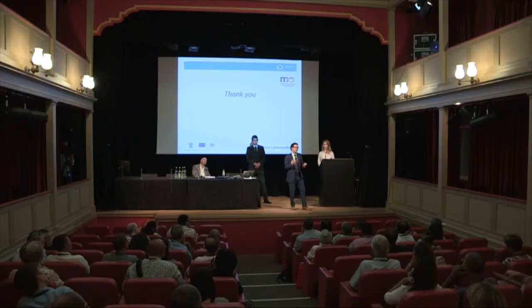But to respond to your point, the more information you can get, the better. It's clear with flicker that we don't have 35 minutes in an optometry practice, and that's why you have these commercially available devices that give you a snapshot of the central measure, which, as we've seen from some of Professor Hammond's work, is a very good predictor of what's going on elsewhere. So there's a lot you can learn from a good central measure, and it's now available that you can do two central measures. So I haven't answered your question, have I?